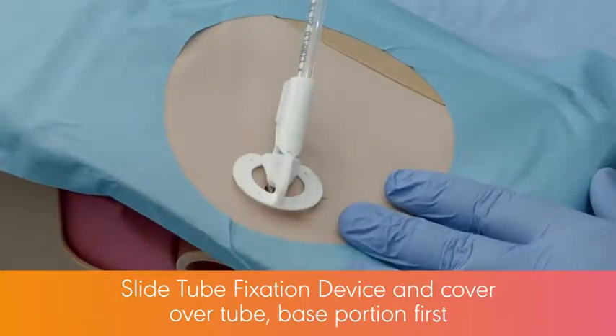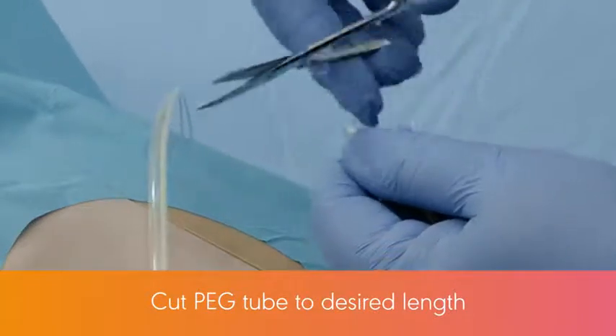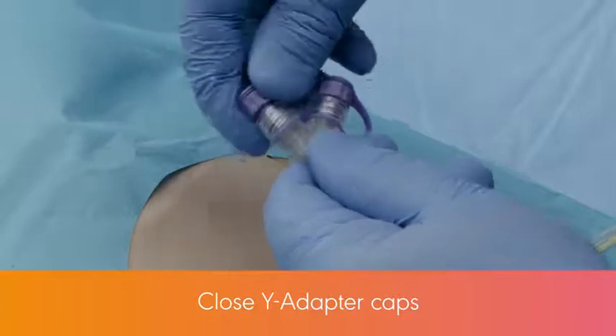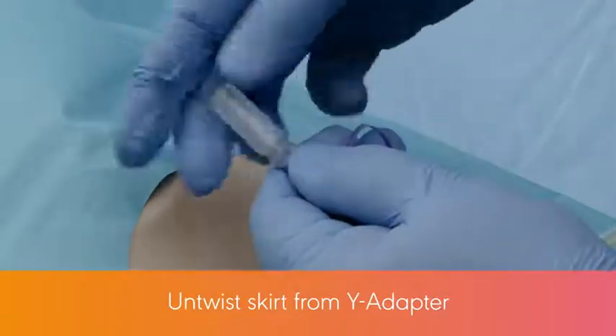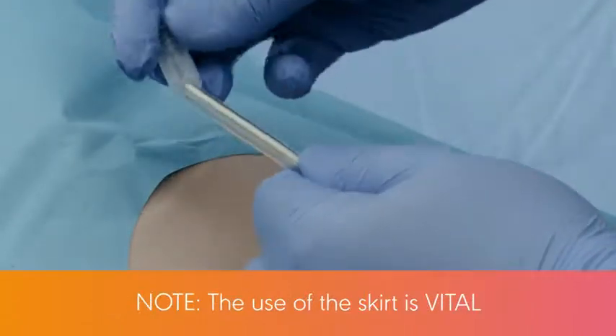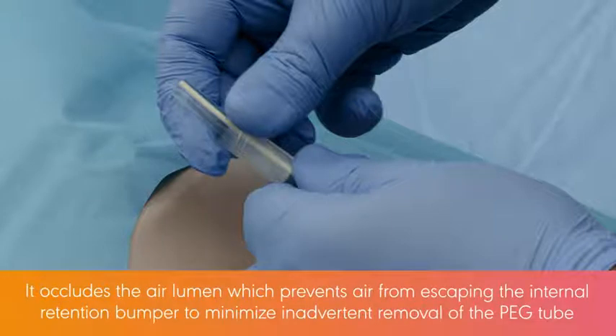The base portion goes first. Cut the peg tube to the length desired, at least 2 inches below the dilator portion. Close the Y-adapter caps. Untwist the skirt from the Y-adapter and put the peg tube through the narrow end of the skirt. Note: the use of the skirt is vital — it occludes the air lumen, which prevents air from escaping the internal retention bumper to minimize inadvertent removal of the peg tube.